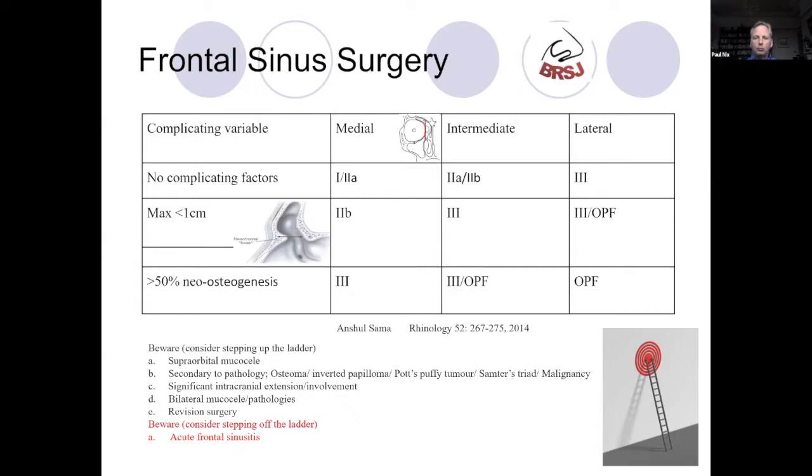And I think the beauty of the paper is really getting me to think about how much access I will need. And if the anterior to posterior diameter is very small, that's from the posterior skull base to where we may drill off on the beak, say less than 1 centimeter, then that's going to be very complicated to maintain long-term patency.